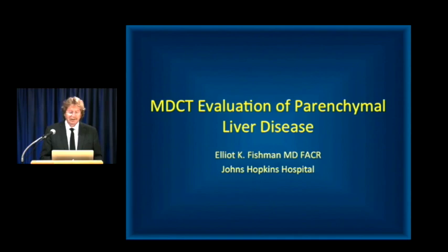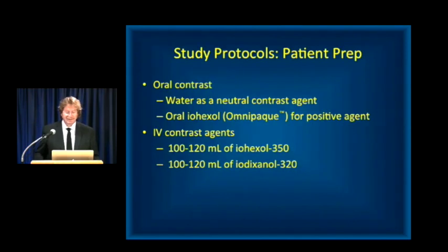And this is going to be on the CT of parenchymal liver disease. There's no doubt when you start looking at CT, protocols become very important, and where you see pathology on what seems to be almost every patient, the liver becomes the top of our list. Now, I will give a couple of talks in this series. One will be on liver masses. This one I'm going to focus on parenchymal liver disease, talk about some of the basic principles, talk about some of the various pathologies, but also start talking about protocols.